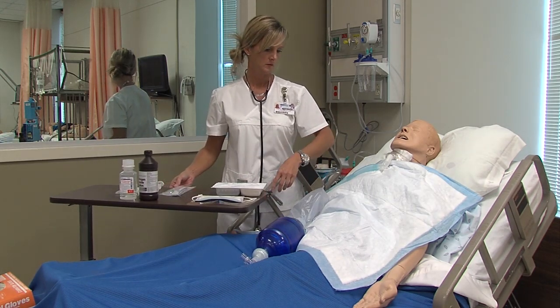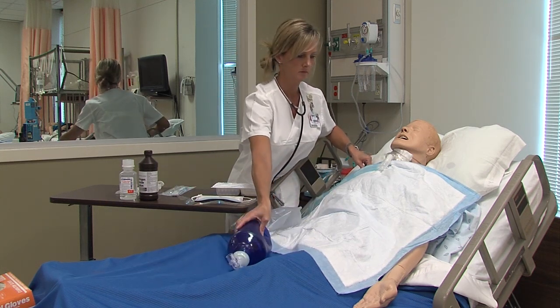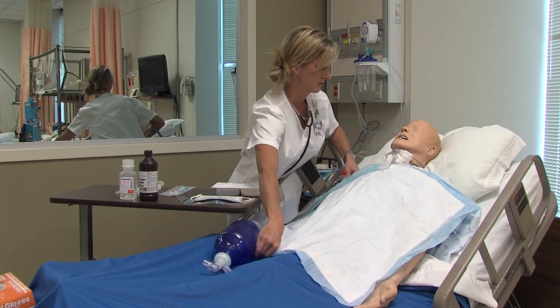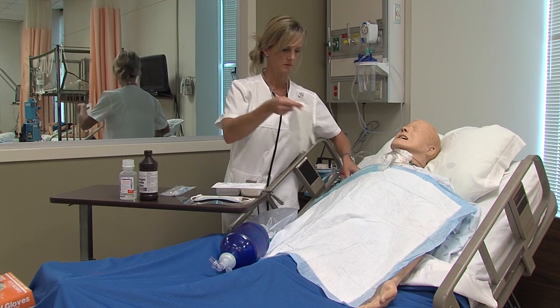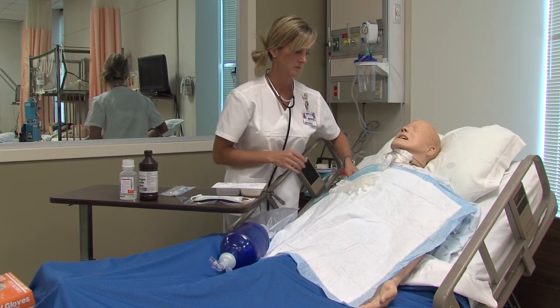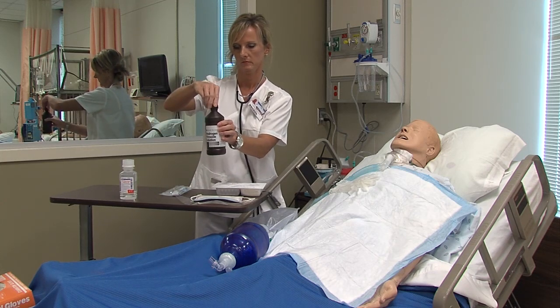Place your clean towel or drape on the client's chest to protect his clothing. You may want to go ahead and put your pair of clean gloves on the towel so that you won't forget to use those later in the procedure. Loosen the caps on the peroxide and sterile saline or water.